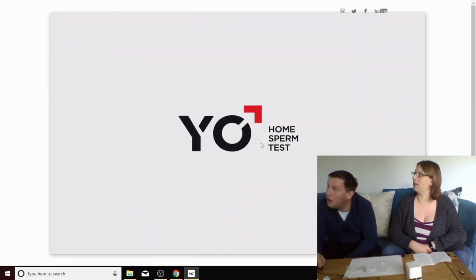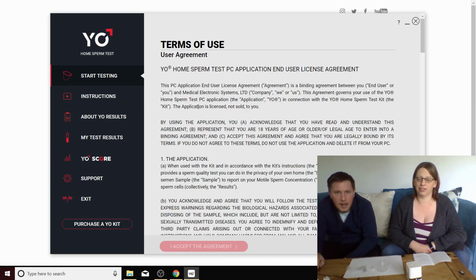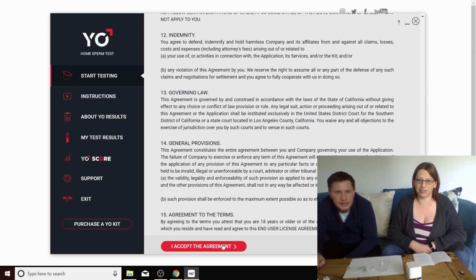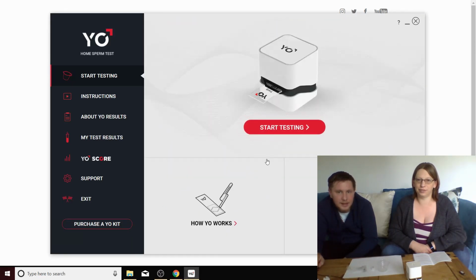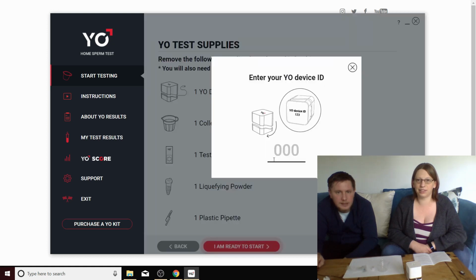Very swish. We got a bit of Yo sperm. So we're going to start testing next. Read this. I already read this on my phone. Pretty standard stuff, just to know that they're going to keep it. So start testing. Remove the following supplies from your Yo kit. Yeah. We've done that. Ready to start.